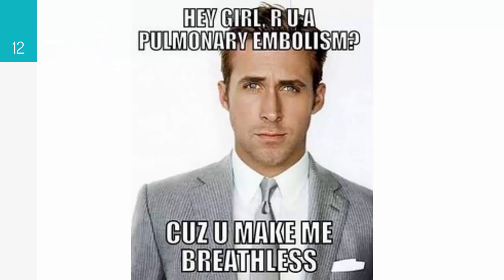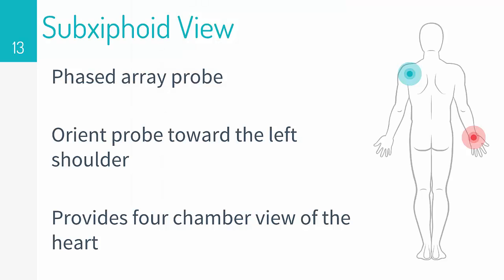Remember, in a hypotensive patient with right heart strain, you need to heavily consider pulmonary embolism and act accordingly.